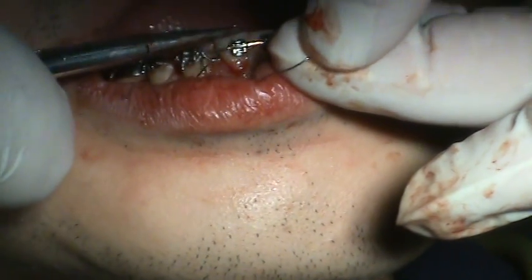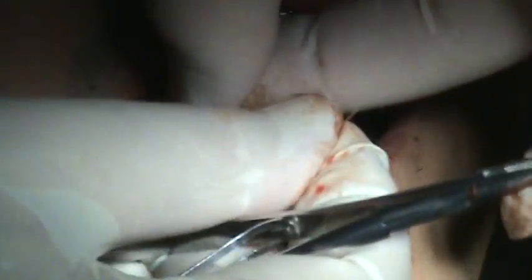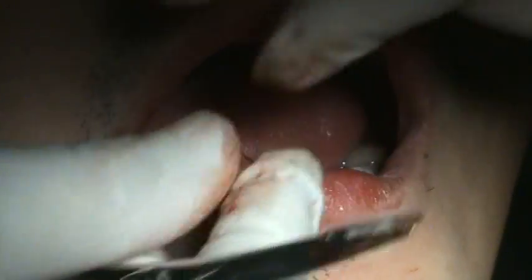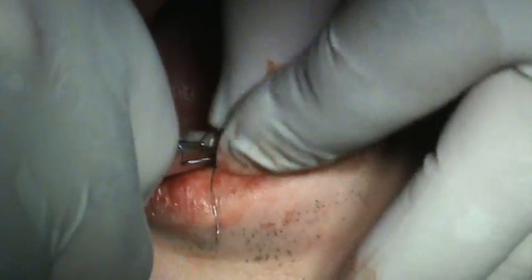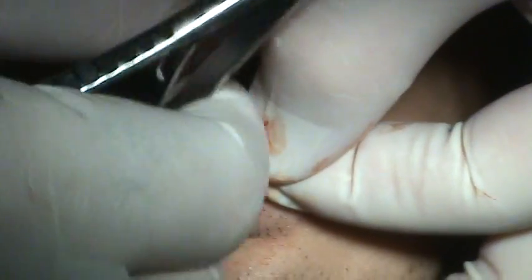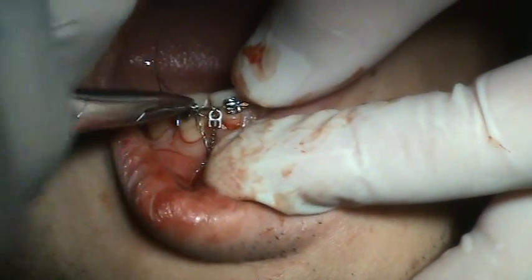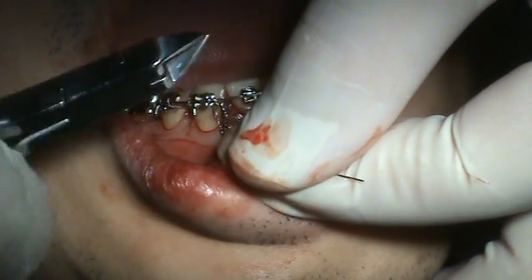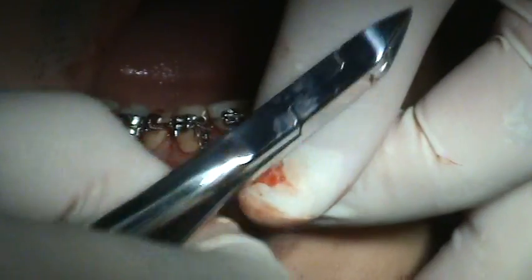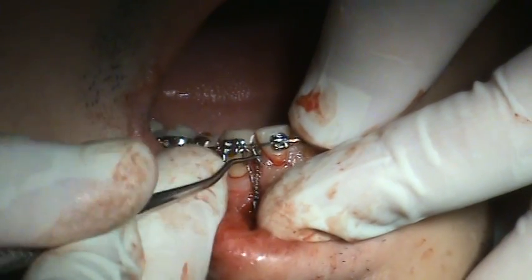So why don't we just take up the full five millimeters. The other side we want to activate five millimeters — the same amount. You want to have one side one force and that side another force. I'll cut this long. It's good to measure and twist it.